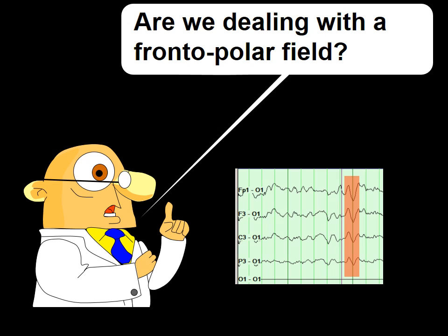So here, I would like for you to answer this question. I think that your answer will be yes. And I am sure that you have already figured out not only the location of the generator, but also the polarity of the generator. Nevertheless, I will go through the logical process that it takes to get to the answer, because it is a good exercise to apply in a situation where the origin of the wave is well known, in order for us to apply it in those cases where the origin of the wave is not known.